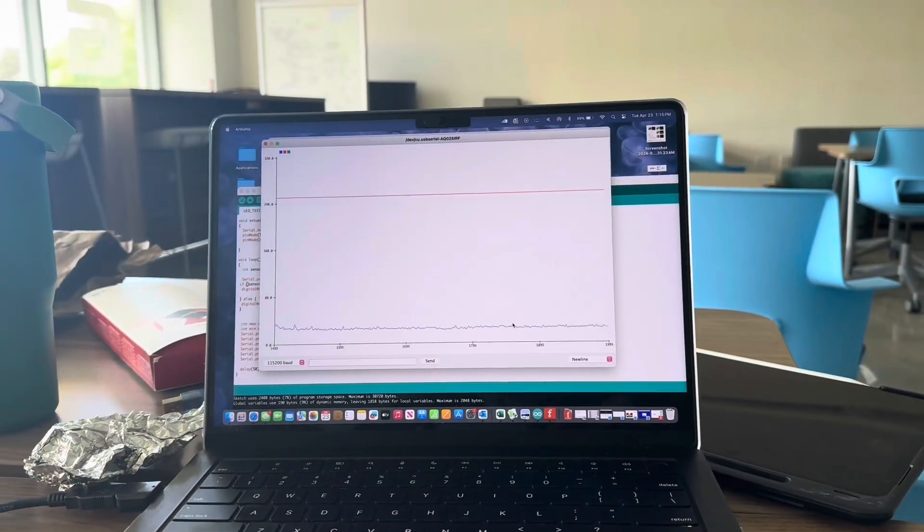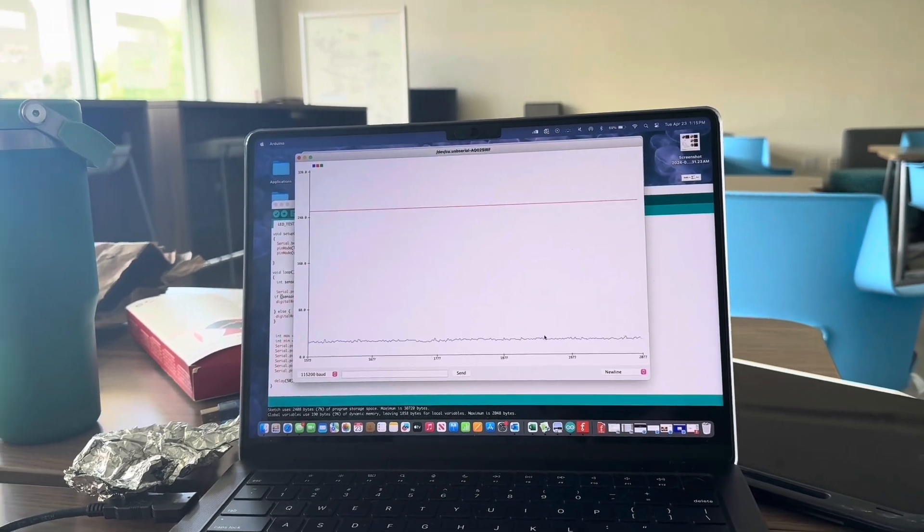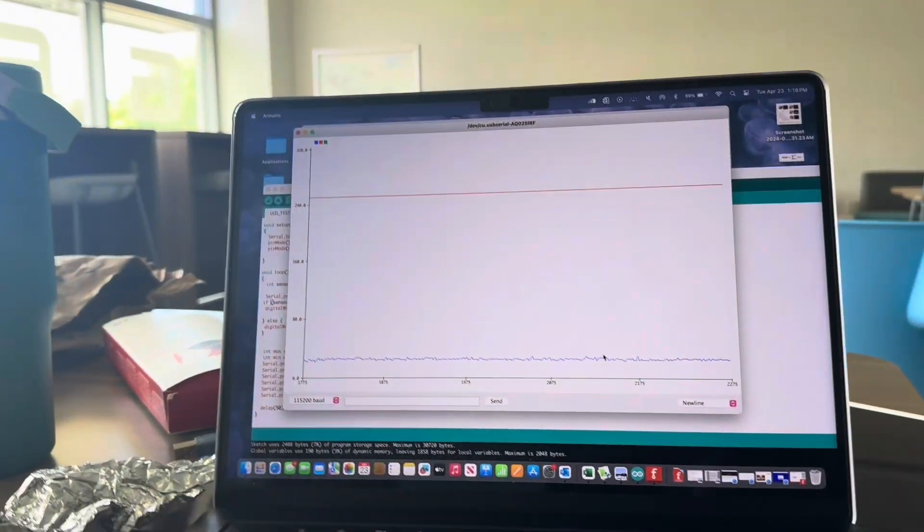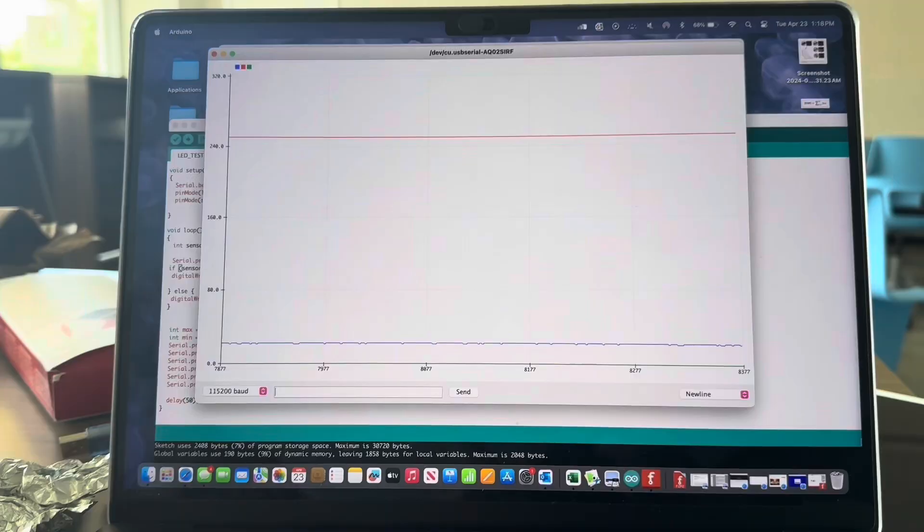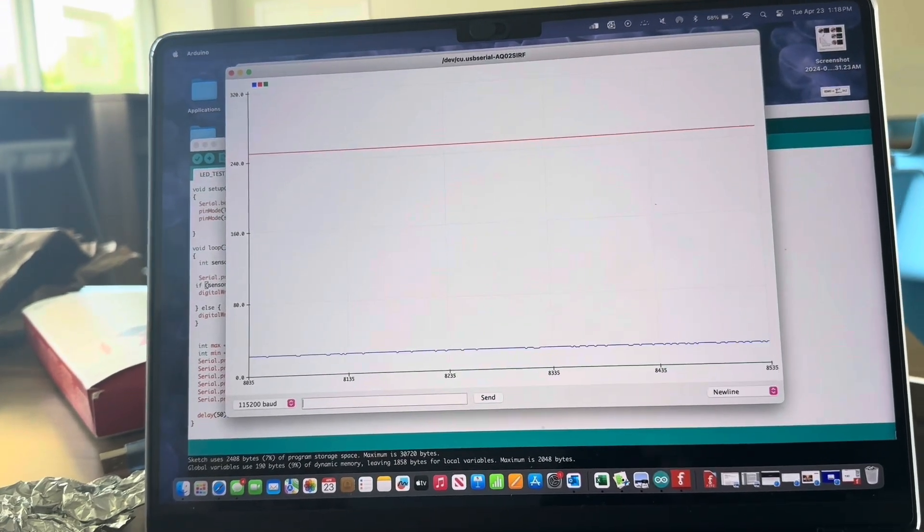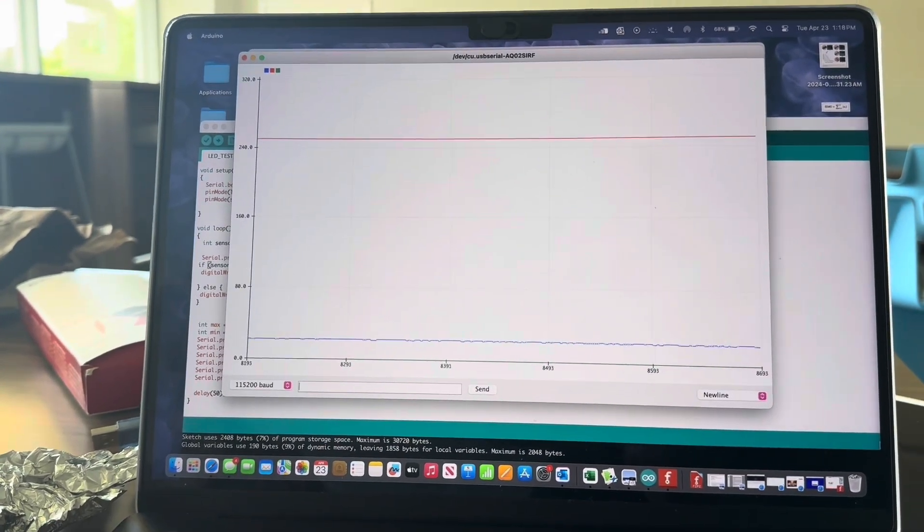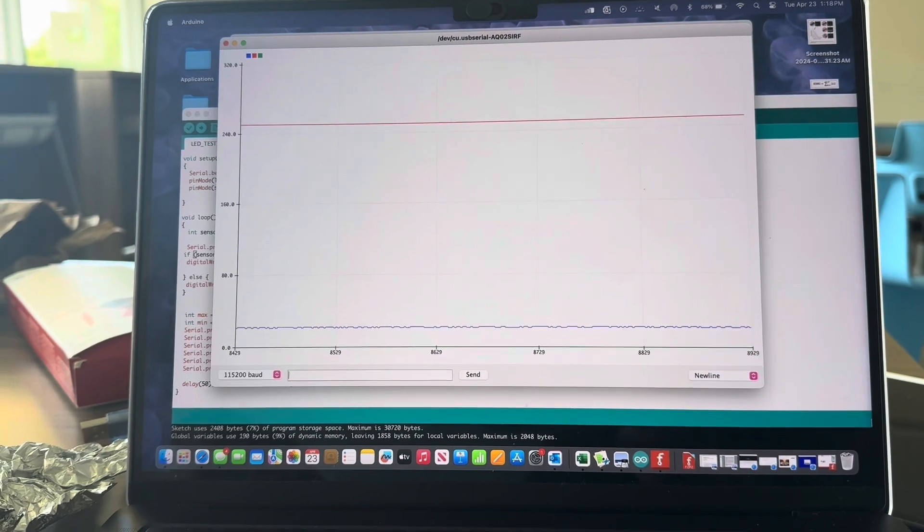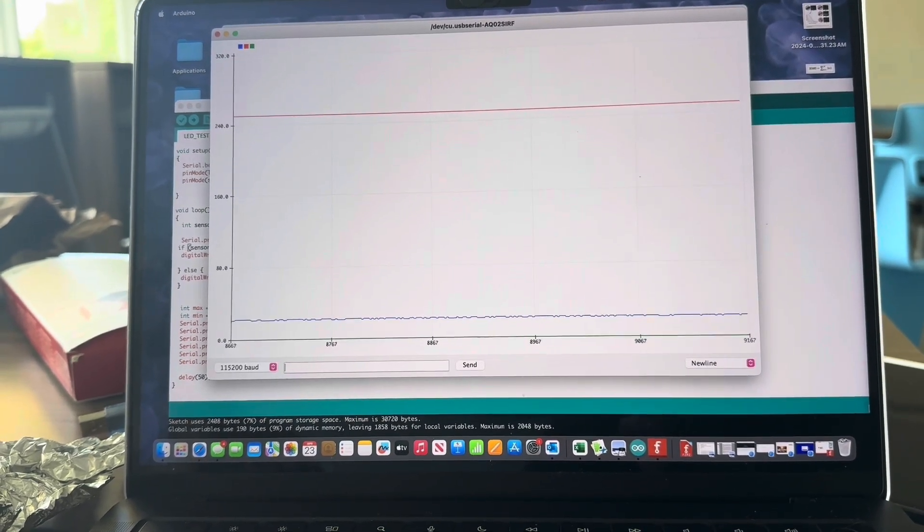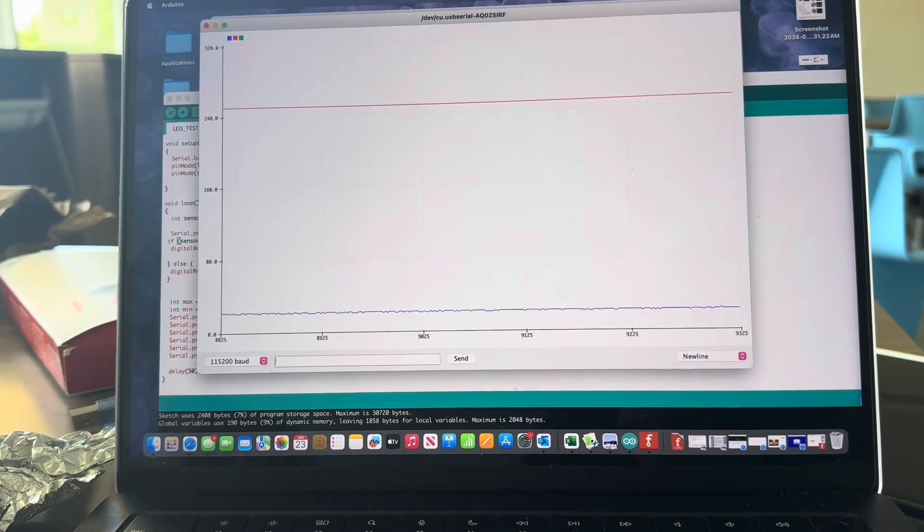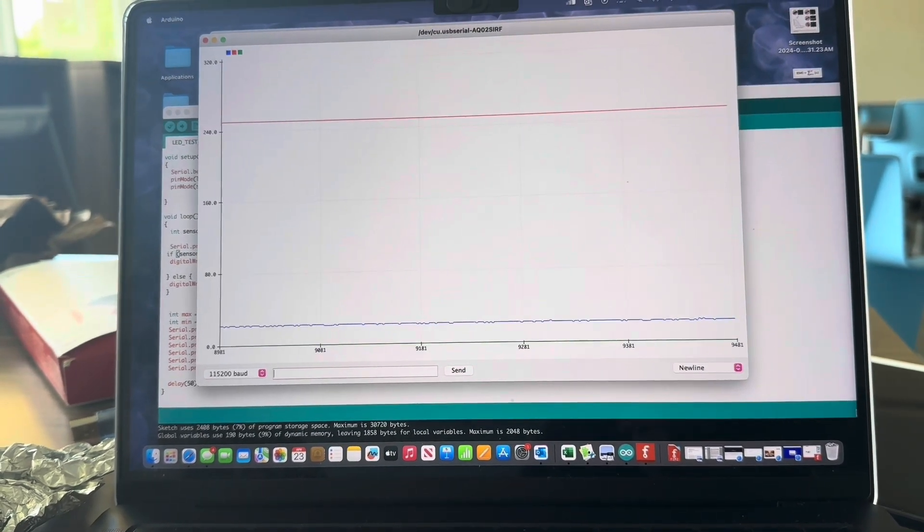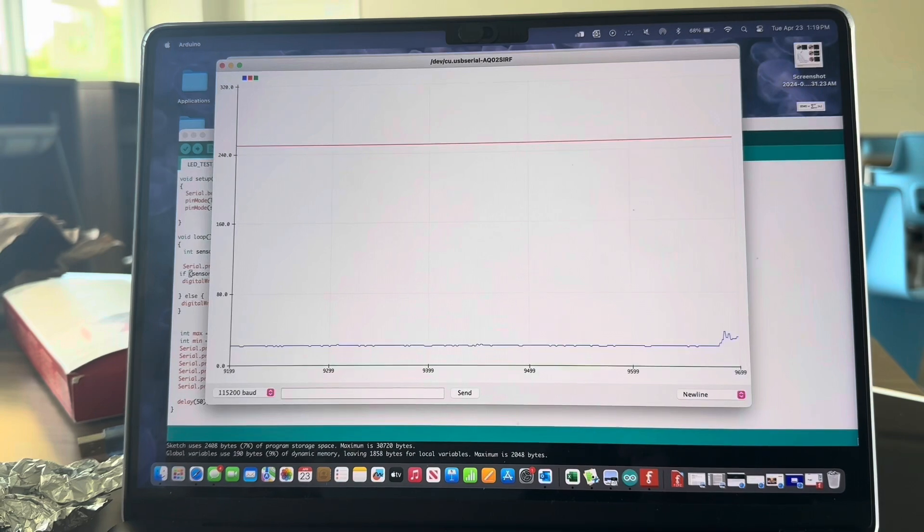In order to conduct the blood pressure cuff test to see if an increase in blood pressure results in an increase in EMG readings, we applied the blood pressure cuff on my upper arm and increased the blood pressure and held it for about three minutes. As you can see here, these are my baseline readings before the blood pressure cuff has any influence on the EMG activity.